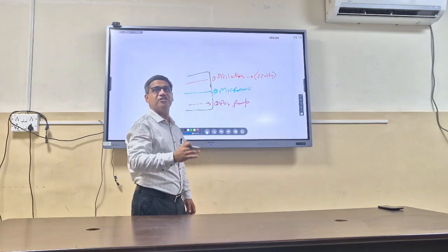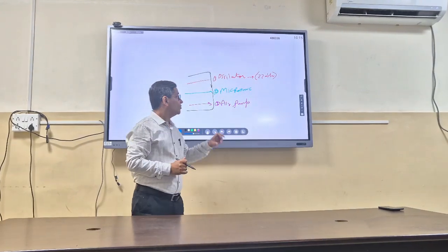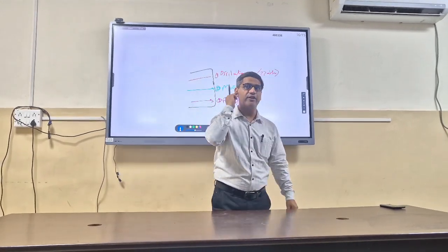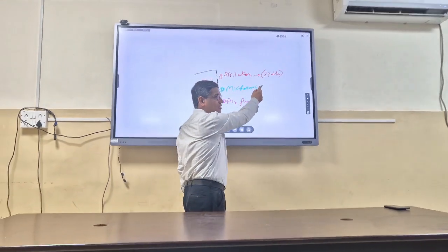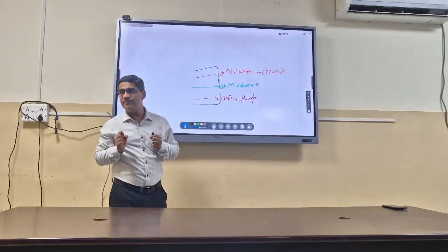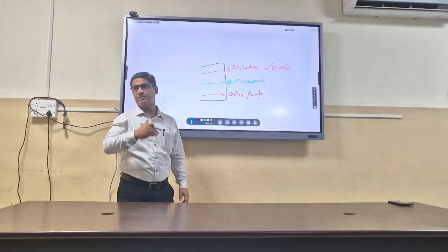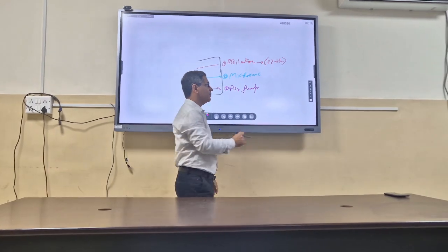It produces pressure changes in the external auditory canal. So this probe, snugly fit into the external auditory canal, has 3 channels: an oscillator to produce a sound of 220 Hertz, a microphone to receive the reflected sound, and an air pump to make pressure changes in the external ear. Now, what is the principle of impedance audiometry?